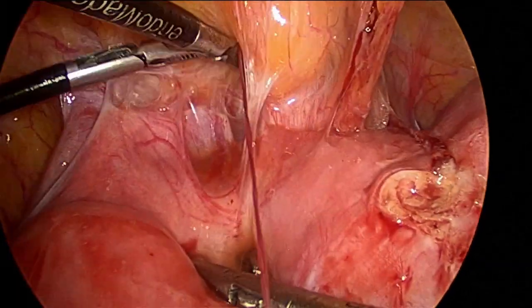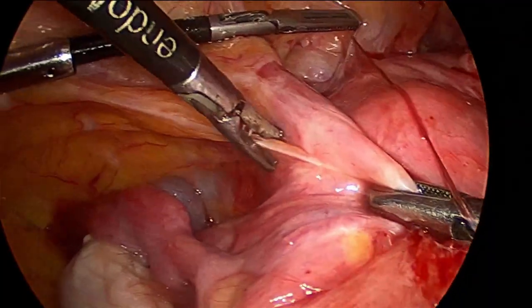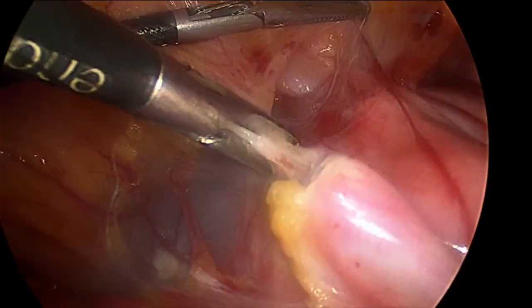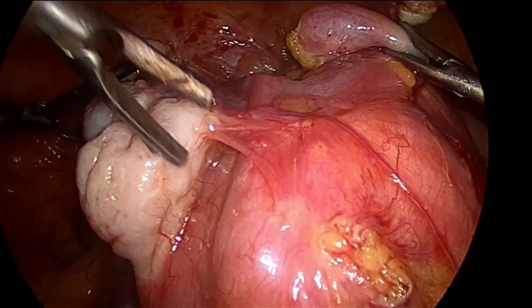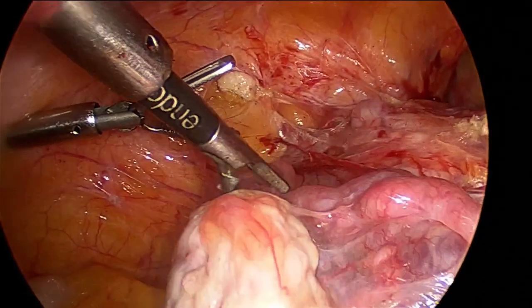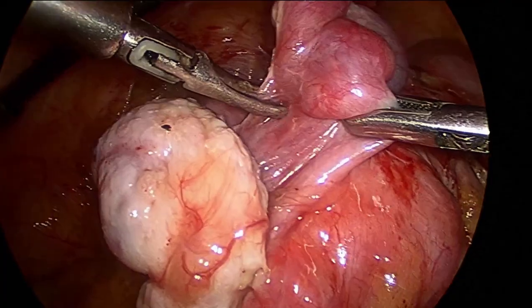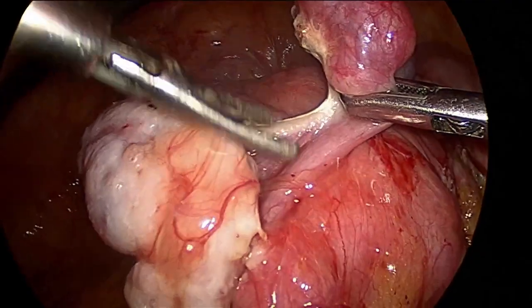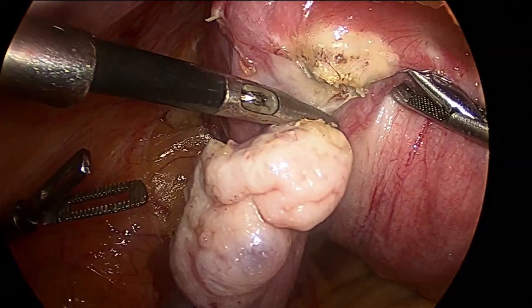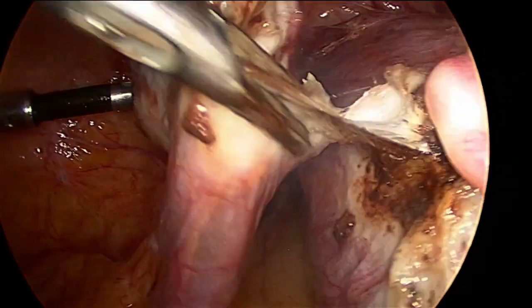First, we proceeded for the left round ligament. We grasped the round ligament and traction was made with the needle holder; the round ligament was well coagulated and cut. The ovary was preserved, so filmy adhesions were released, then the tubo-ovarian ligament was cut, remaining near the fallopian tube to avoid injury to the ovarian vasculature. The ovarian ligament was well coagulated and cut, and further the posterior leaf of the broad ligament was dissected deep down.